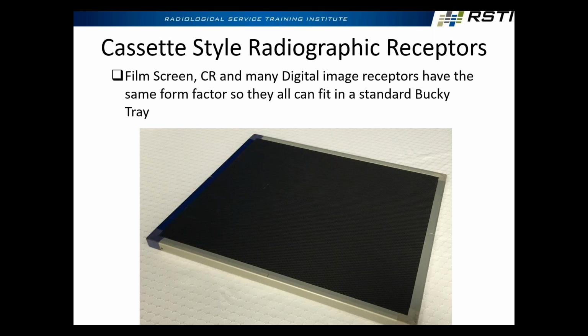CR as well, largely going away. There are still places that will use it, but the federal government, in an effort to streamline things, there was a big push to get everybody to go DR. And the way that they encouraged that was by reducing the Medicare and Medicaid reimbursements for CR-based images. So it hit them in the wallet, right? From one year to the next, they cut the reimbursement in half. The year after that, they cut that in half again, and the third year, it just went away altogether.